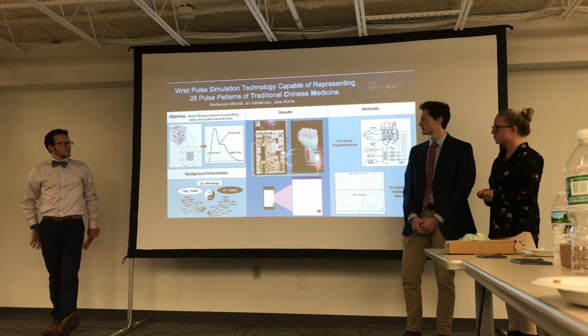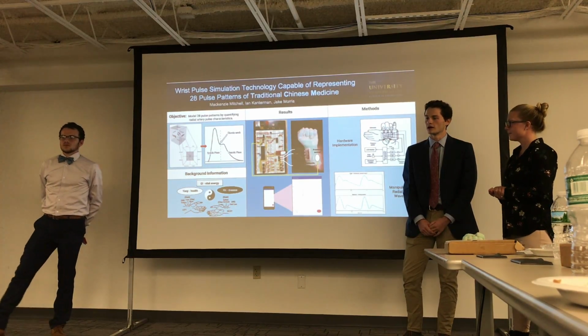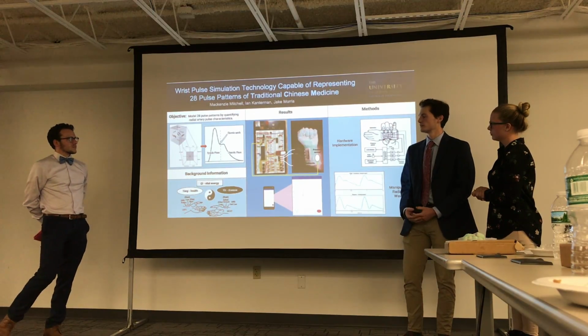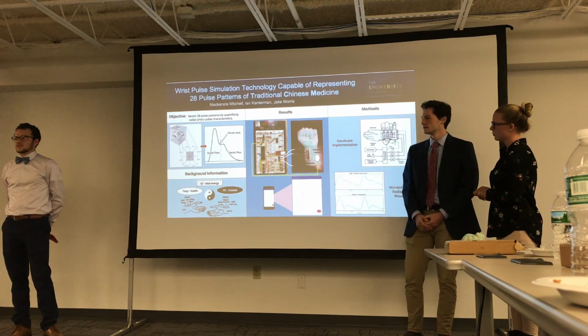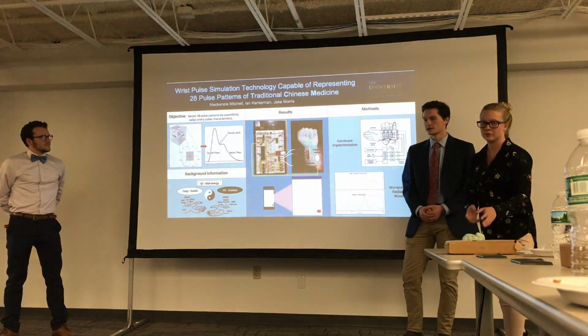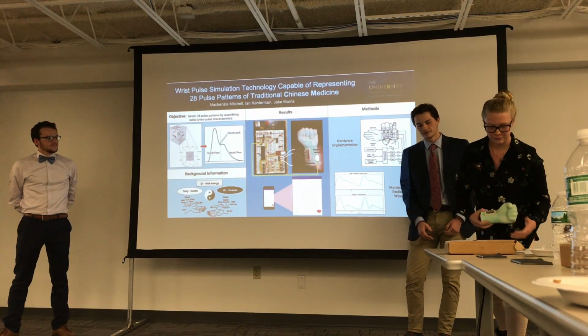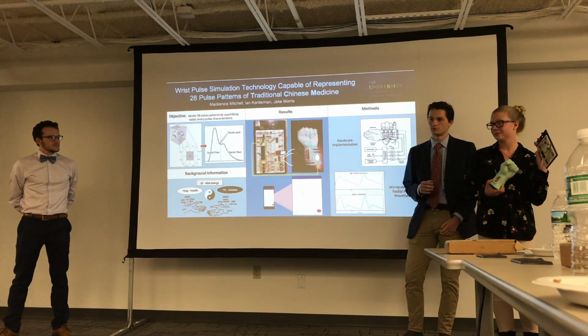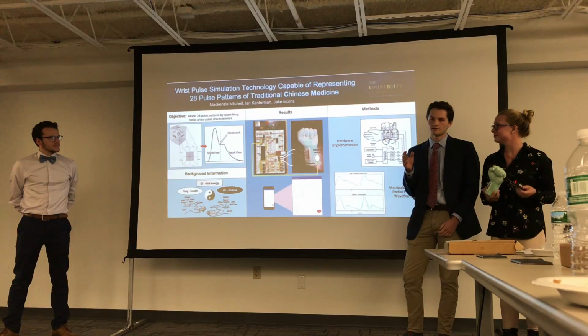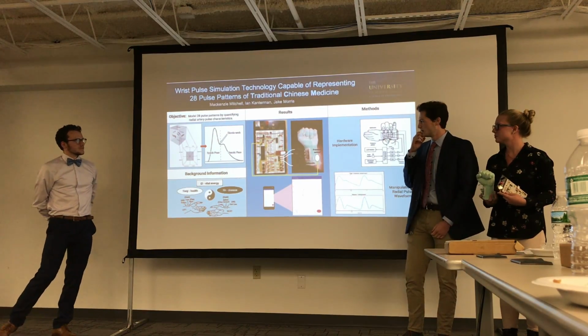This year's project focuses a lot more on software, but obviously we will be improving the hardware that was previously designed. Currently the hardware, as Ian explained, uses a microprocessor to drive current into 3 solenoids which push up against your fingers and simulate the feeling of a pulse.